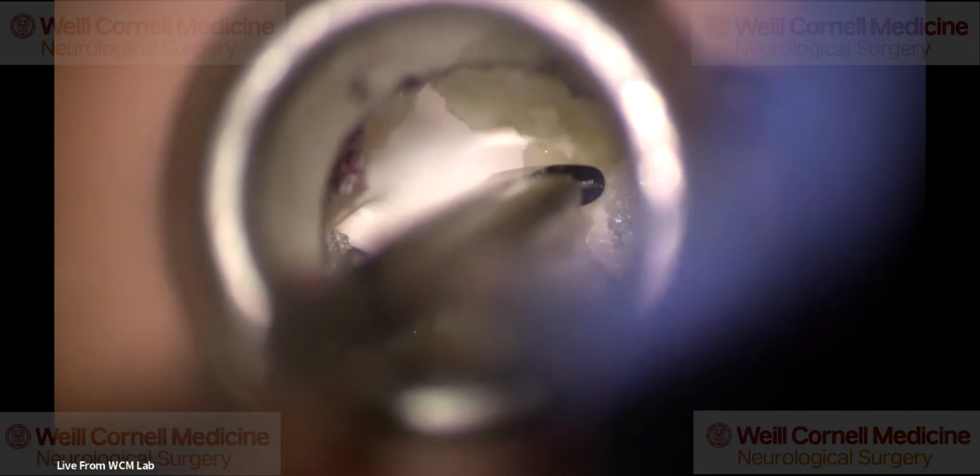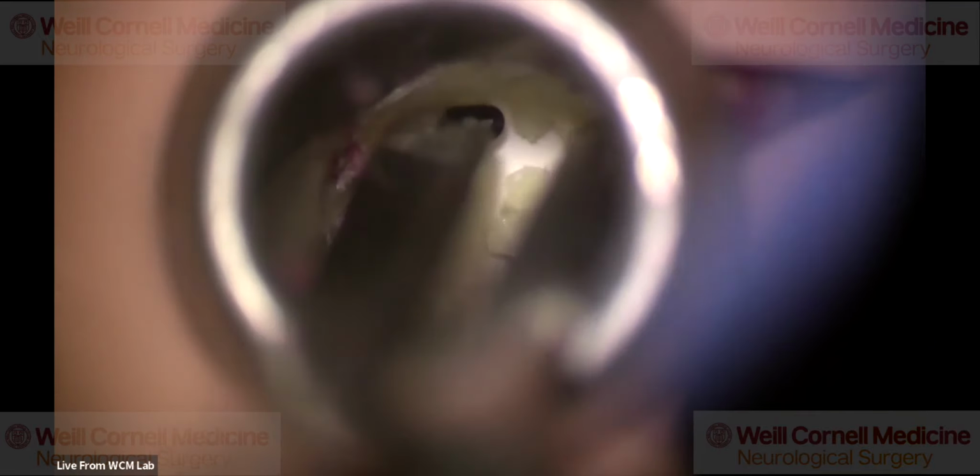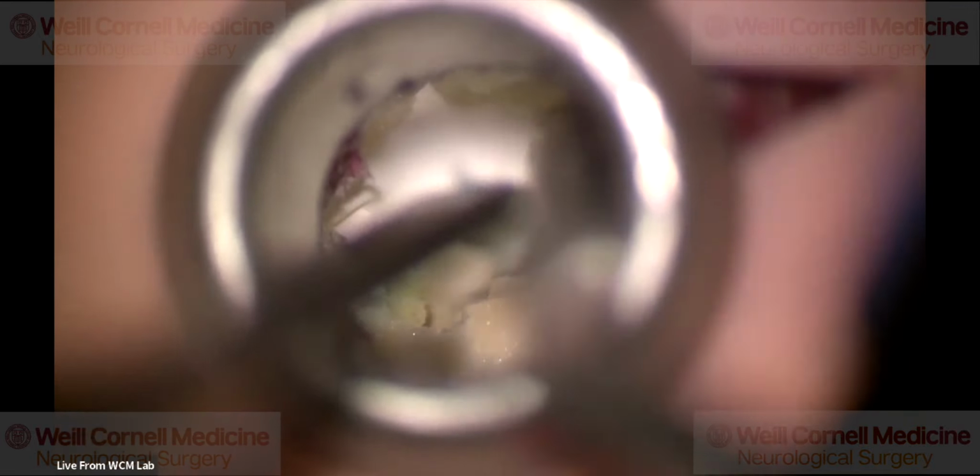Now that's the C5 lamina here. And then obviously you can do a little bit of a laminotomy, laminectomy here. I could go more medial. I can angle the tube more medial if I think that I have to do a midline decompression as well.